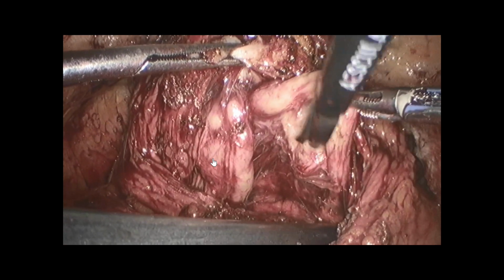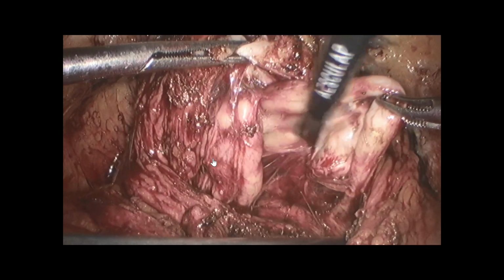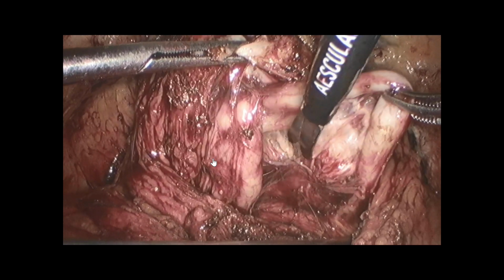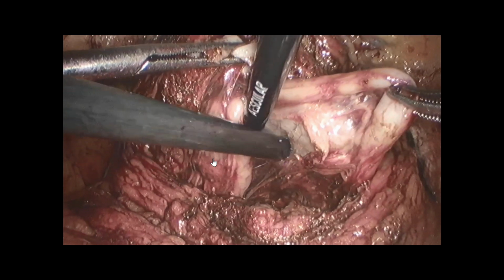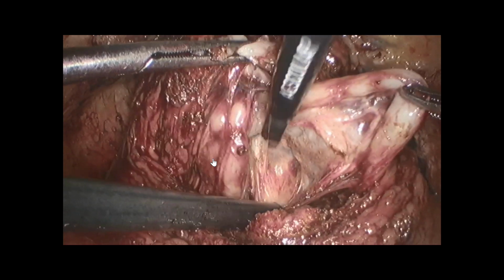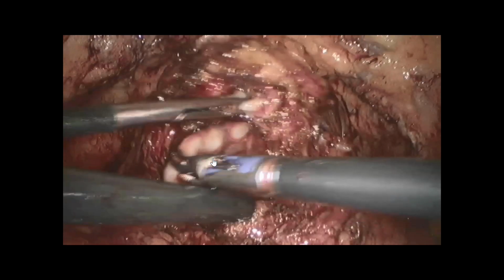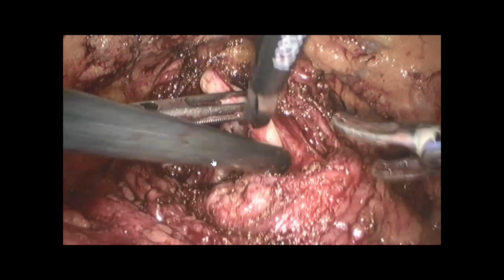And I like to start like this. I mean that you see the vas. Inside you see the seminal vesicle, and then here you have this layer. You just have to get in this typical space, and the Denonvilliers fascia remains intact. And then you have like a wheel, and you can now see inside the seminal vesicle, the vas deferens.